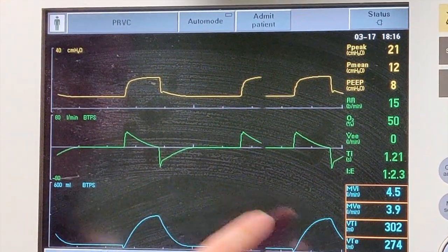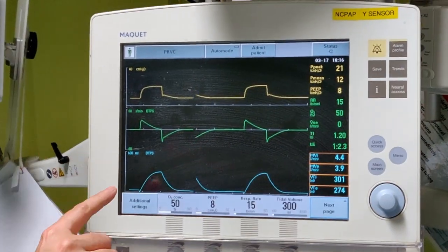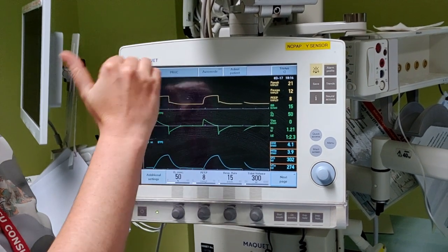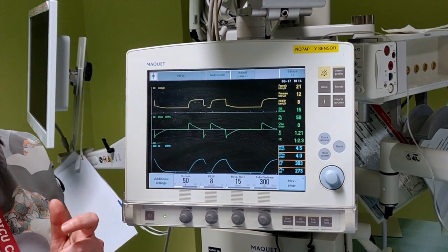So be mindful, in this ventilator there's a contingency plan of activating a volume control breath, but some ventilators won't do that, they will just adapt up and down, so you will have a few breaths where you will be either over or under ventilating when the compliance or the resistance change.